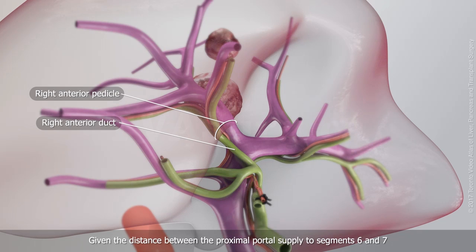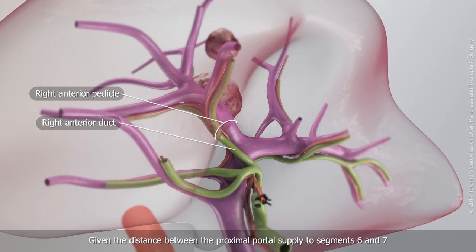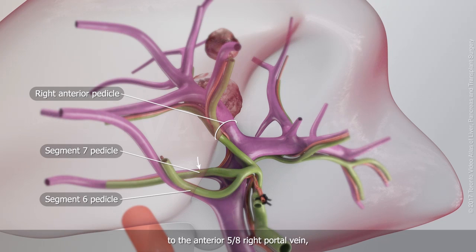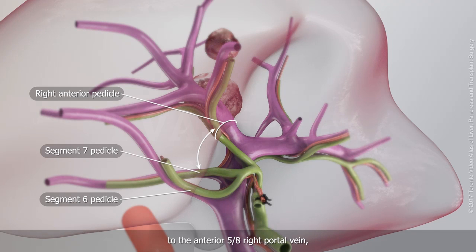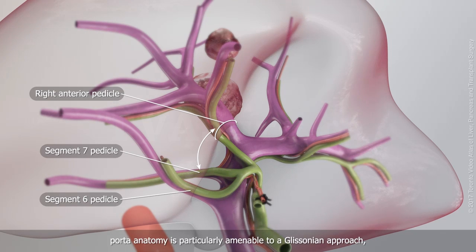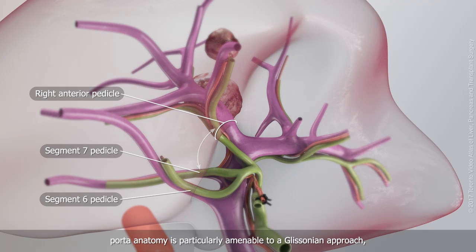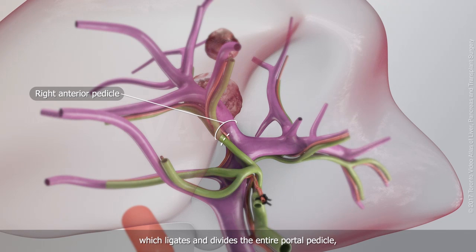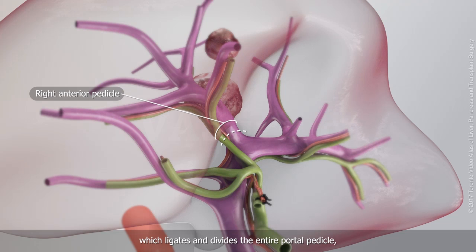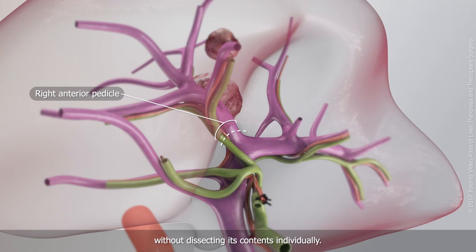Given the distance between the proximal portal supply to segments 6 and 7 to the anterior 5-8 right portal vein, porta-anatomy is particularly amenable to a Glissonian approach, which ligates and divides the entire portal pedicle without dissecting its contents individually.